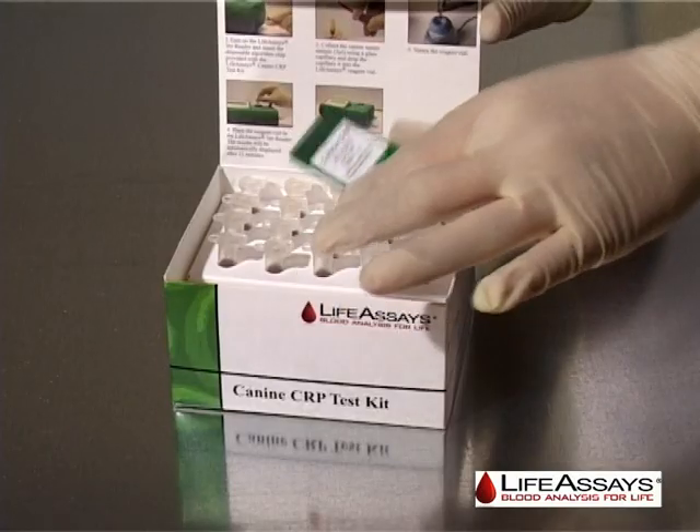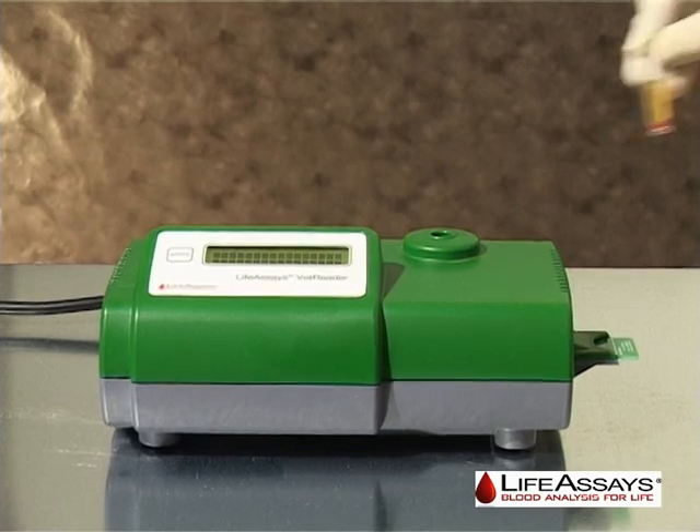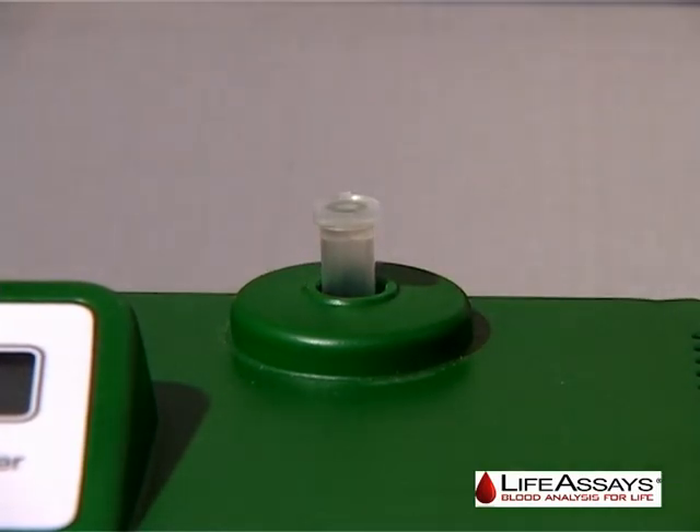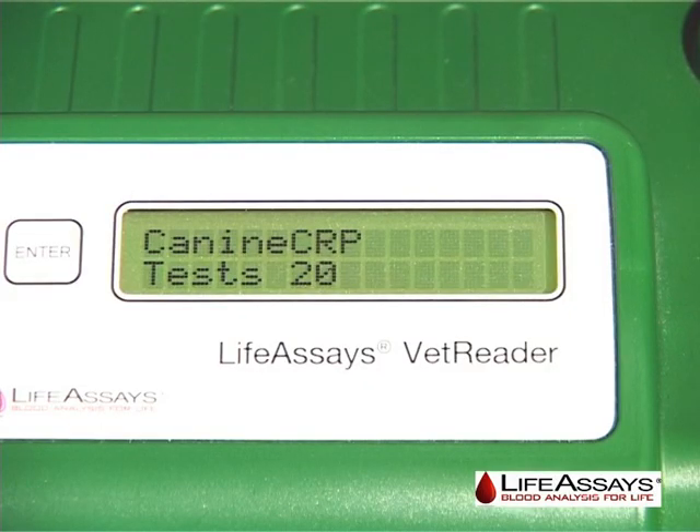This chip is provided with each reagent test kit. On the front of the instrument is located the internal coil for inserting the reagent vial and the LCD display for instruction and measurement display only.